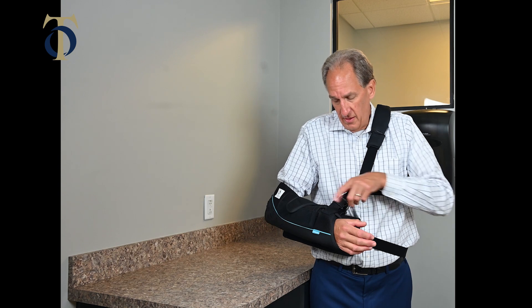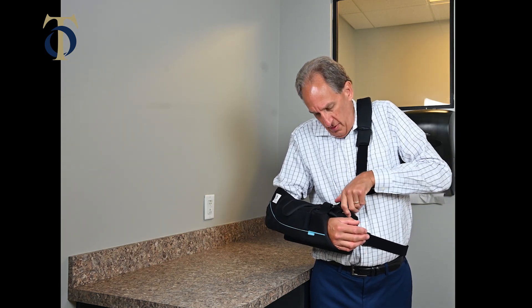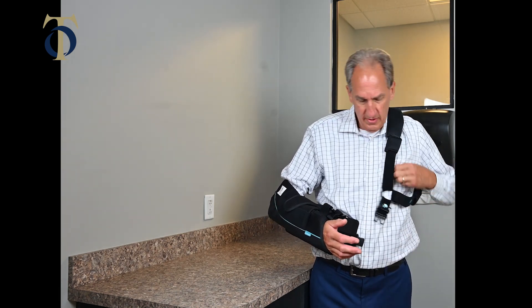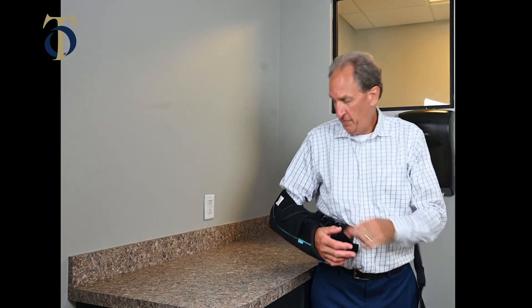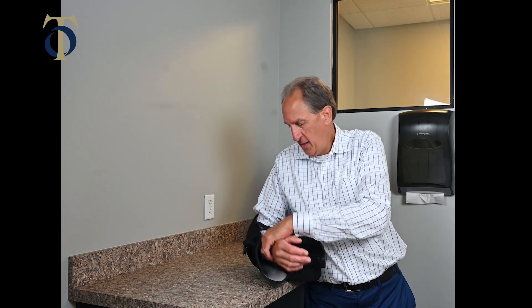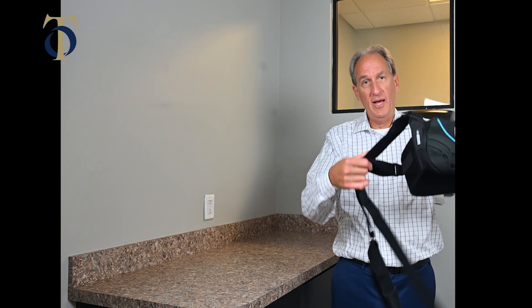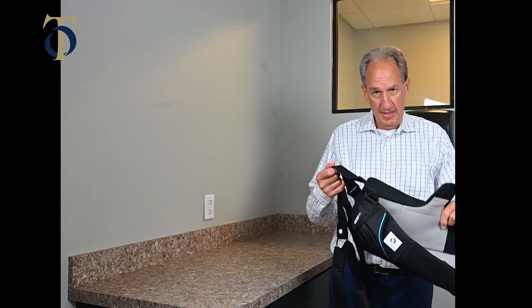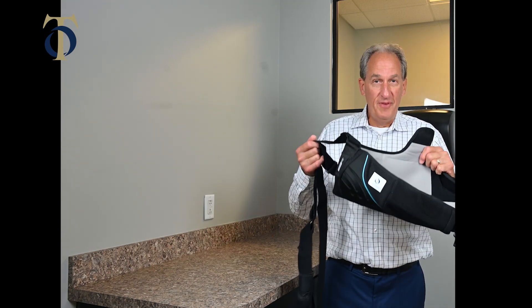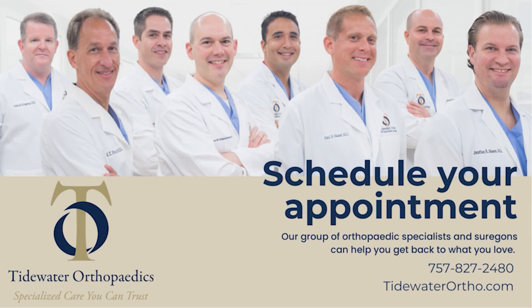To come out of the sling, just reverse the order. Three clips — one, two, and then the third. Once you've unclipped it, take the strap off the shoulder, rest your elbow down, undo the strap holding it in place, and then lift your arm out. This is how it stays until you're ready to put it back on. Hopefully this answers a lot of questions about sling use. If you have any concerns, give our office a call — we'll be glad to help make it more comfortable.